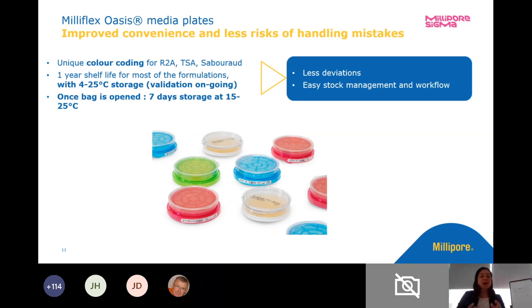On to our media plates. Our media cassettes — if you are using basically any media, you know that a lot of media looks like the same color. So we've incorporated a color coding design into our media. We've got different colors to represent TSA, SDA, and R2A, so there will be no confusion if you're using multiple media types for your various samples. We do have a one year shelf life on most of the formulations. We are validating the 4 to 25°C room temperature storage, and once the bag is opened, that particular media sleeve can be stored for an additional seven days.